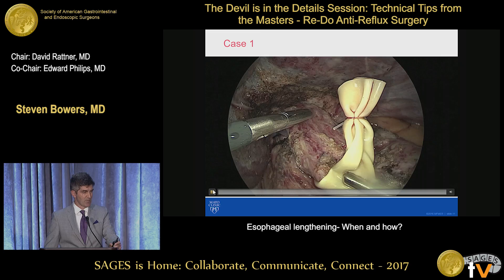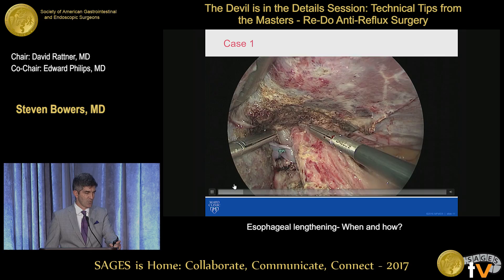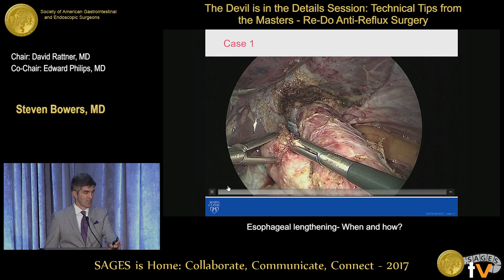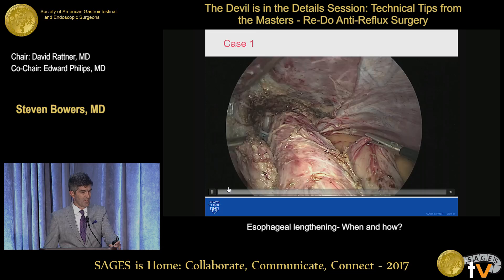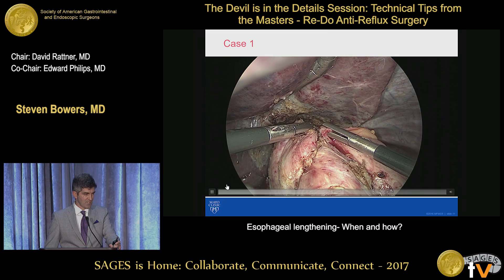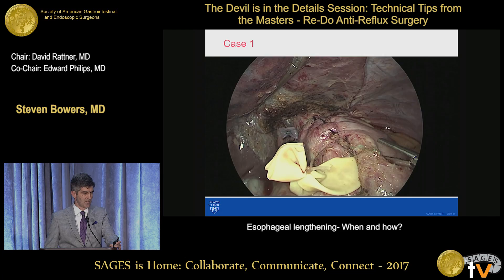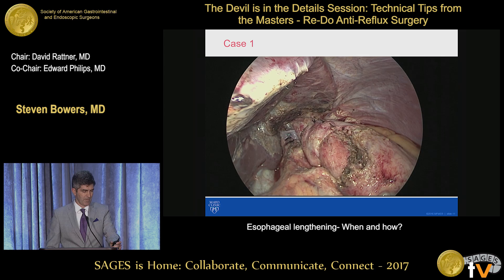So then we have to be able to deal with that at our revisional operation. Note that the cardia is really a tubularized structure, so a Collis gastroplasty really doesn't help you that much in this setting. What's very important is that your fundoplication absolutely has to involve the native GE junction. So you may have to include some of that tubularized cardia in your wrap, but the very uppermost or proximal suture has to include esophagus. This is a Nissen fundoplication redo around the 54 French bougie, making sure that where we've endoscopically identified the true GE junction is included in the wrap. And with that, we can get very good results, even with multi-revisional operation.